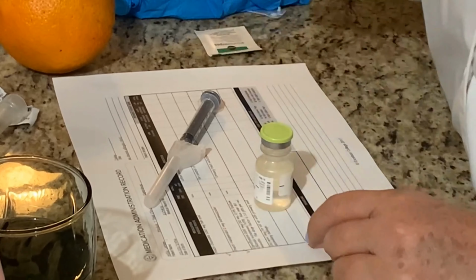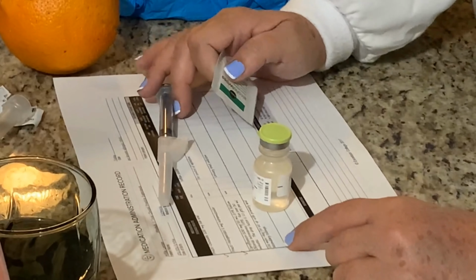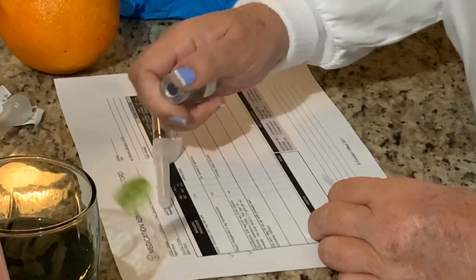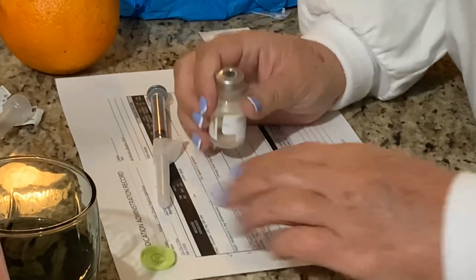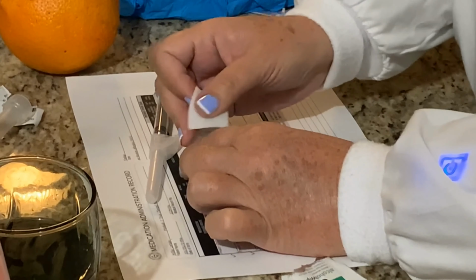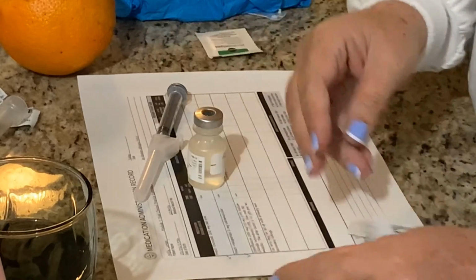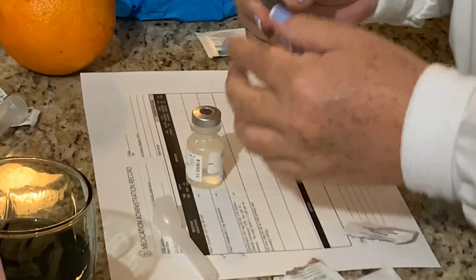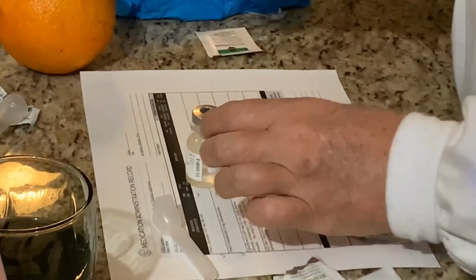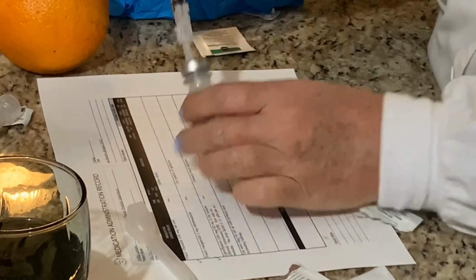I don't need gloves on until I am at the bedside injecting it into Millie. Remember, your gloves are to protect you from any blood or drainage from the patient. So this has a cap on it. I still have to clean the top for about 5 to 10 seconds with an alcohol swab. And then I'm going to remove my cap, and I'm going to draw up 0.4 mLs of air and very carefully inject that into the bottle. And then I'm going to turn it up.